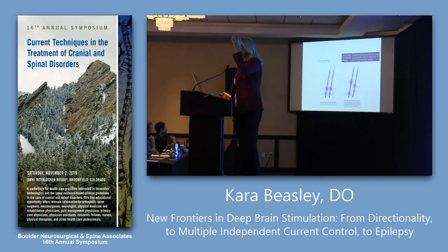I was going to show you a nice little animation, but it didn't work. That's okay. So the other thing that we have available to us is, for the first time ever, we have 8 contact leads in the brain.